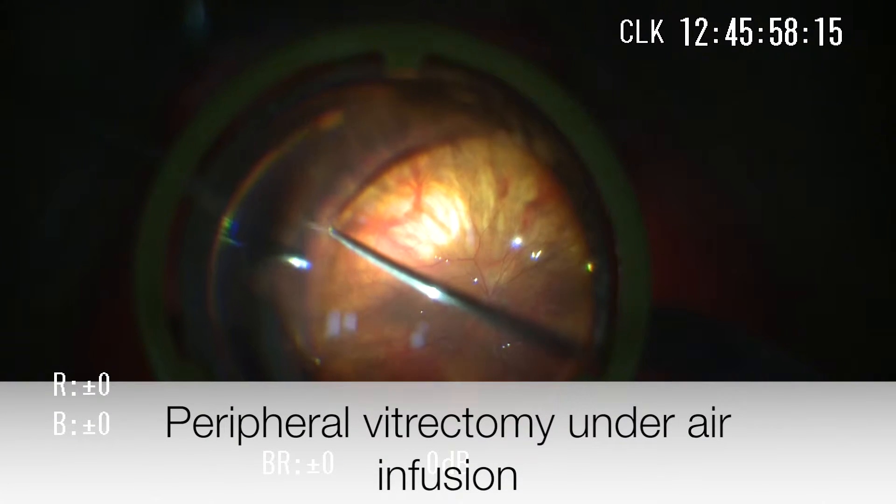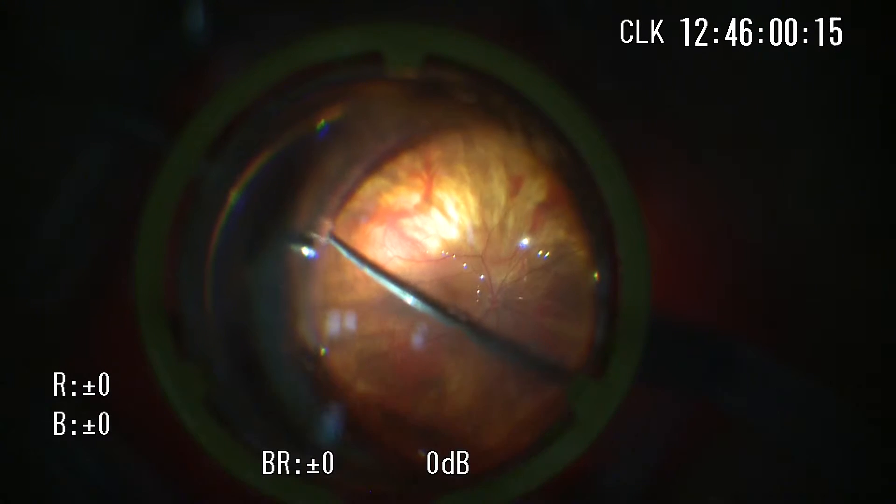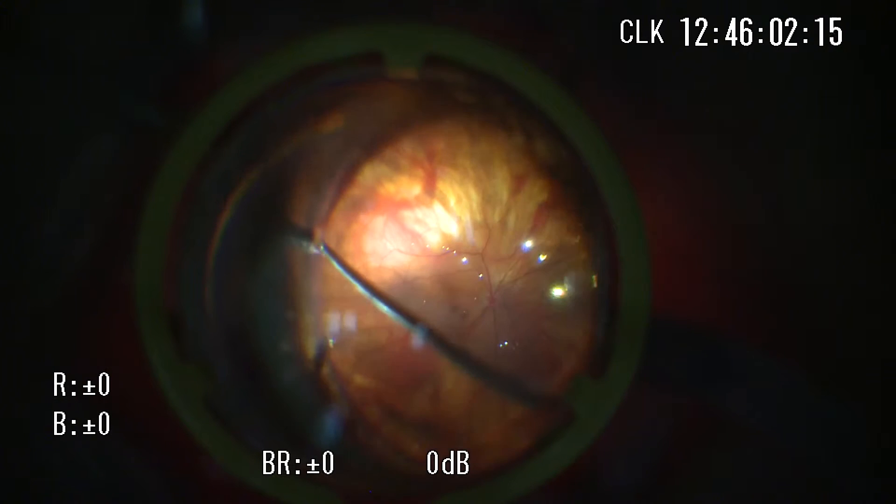Complete peripheral vitrectomy is required in cases with fibrovascular proliferation and rhegmatogenous retinal detachment.